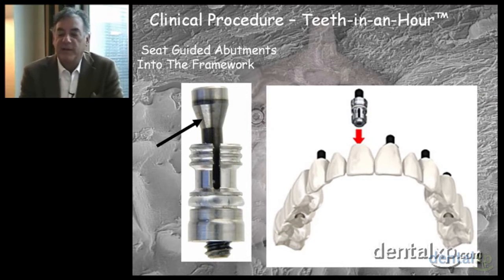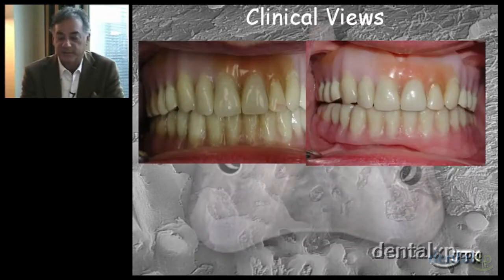You can see on the left the clamping aspect on the bottom. There's a slot on the top and the conical screw. So as you're turning the conical screw into the abutment, it gets locked into the titanium sleeve within the prosthesis, clamping the prosthesis to the top of the implant. This allows for very, very minute discrepancies which could occur. We've found that the discrepancies are in the 0.1 millimeter order, and I have not personally had any cases that have not seated for our patients.